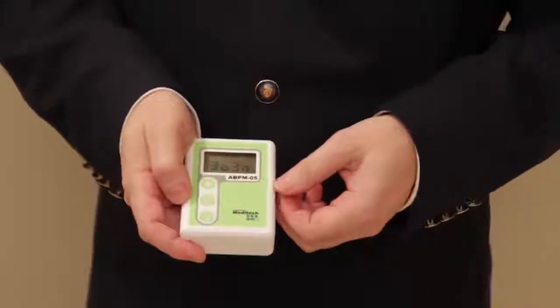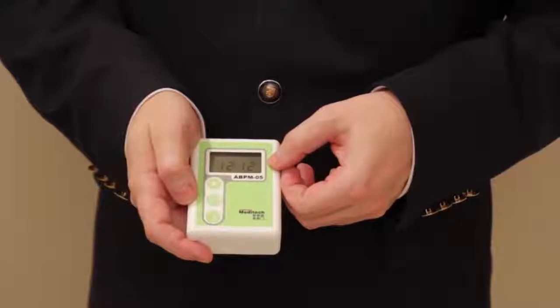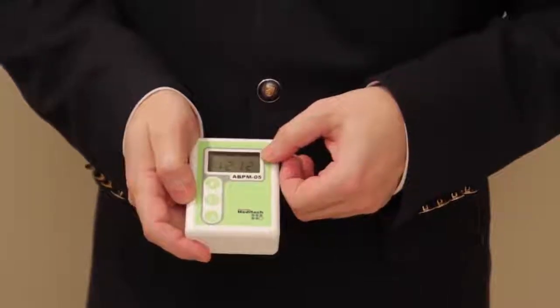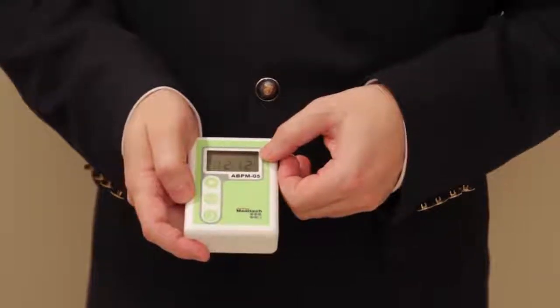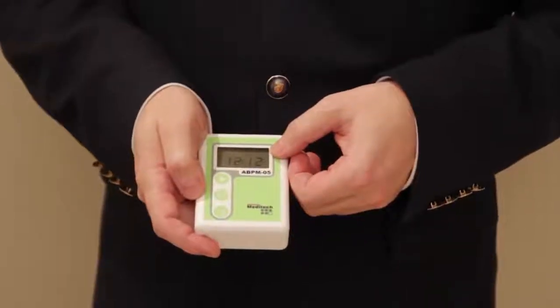This will show that the device will start now measuring 30-minute daytime, 30-minute nighttime measurements. Then it switches back to the clock, and now it's programmed. It will start the plan in about a minute.